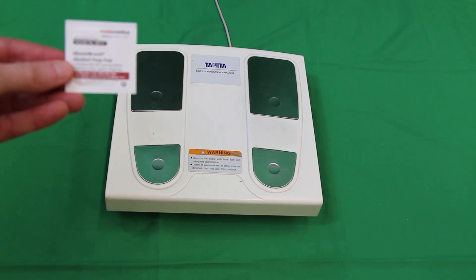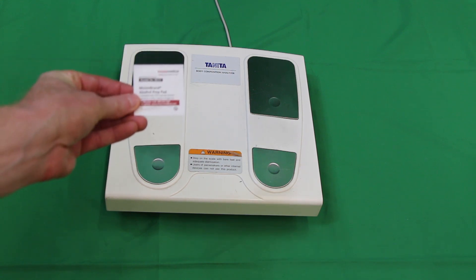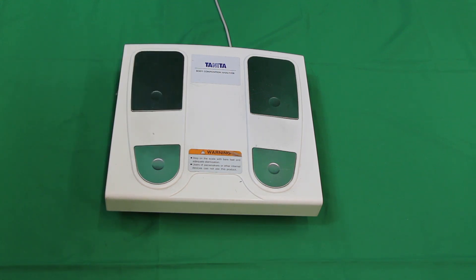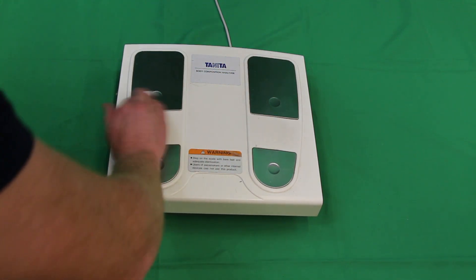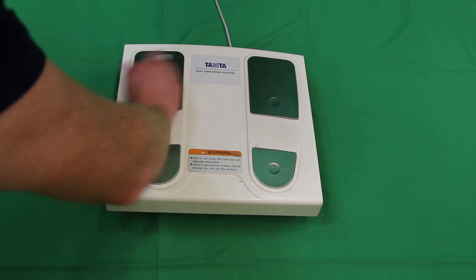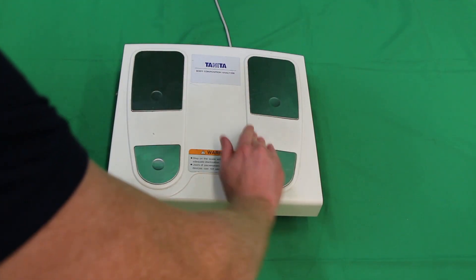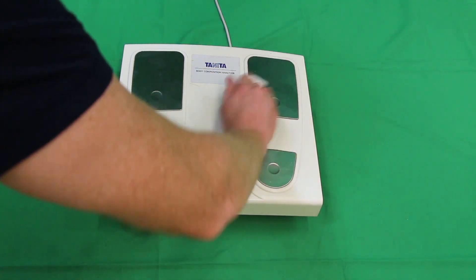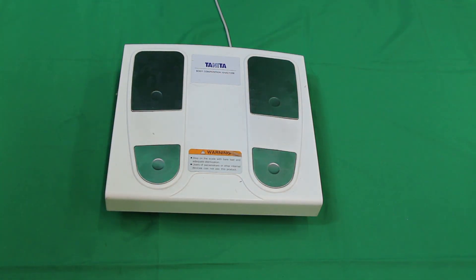This is the alcohol swab that we use — it's just a more medical brand, nothing special. All you do is take the swab and come down and clean the entire foot pad, wiping it down and making sure that you can visibly see moisture coming off the alcohol swab and onto the foot pads themselves. That's how you ensure you're cleaning properly and not infecting people between uses.